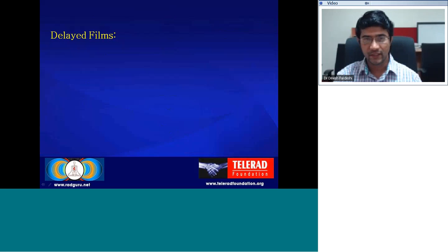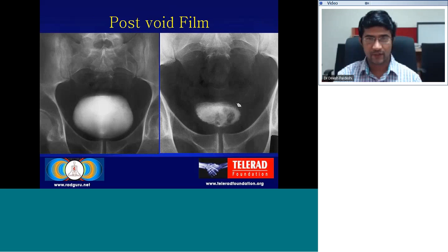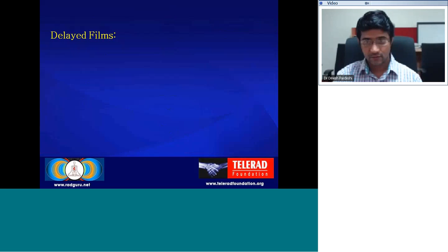Okay, so with the delayed films, normally in cases up to 1 hour the entire study is usually over. But for example, in a patient with upper urinary tract obstruction, where there is a dilated pelvicalyceal system and the ureter is not yet opacified, in those cases the delayed films are very helpful. The delayed films are usually taken in a particular sequence up to 8 hours.